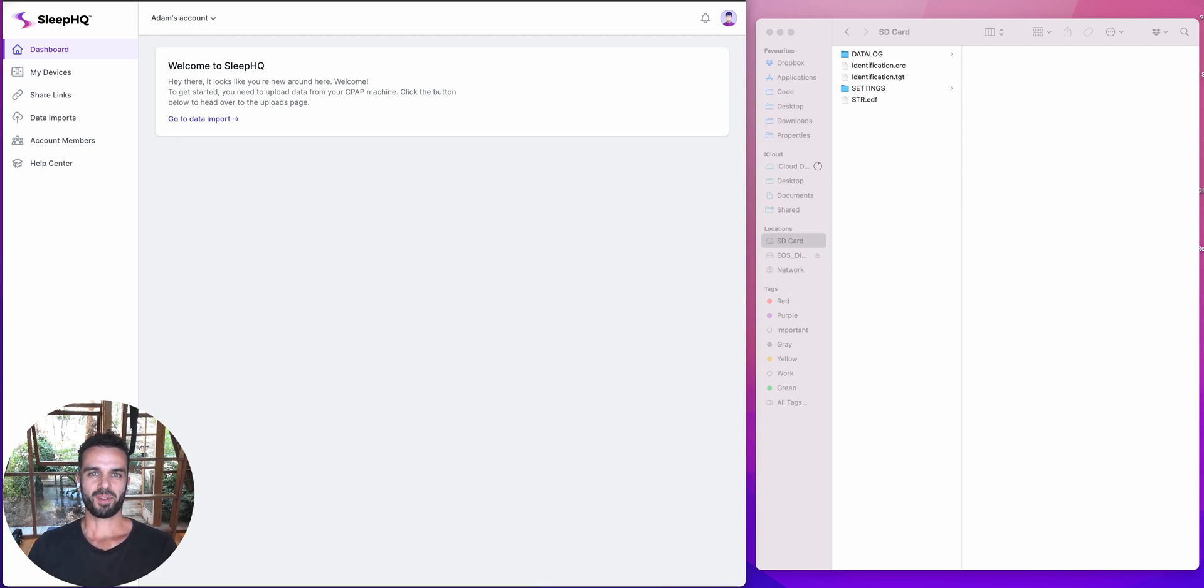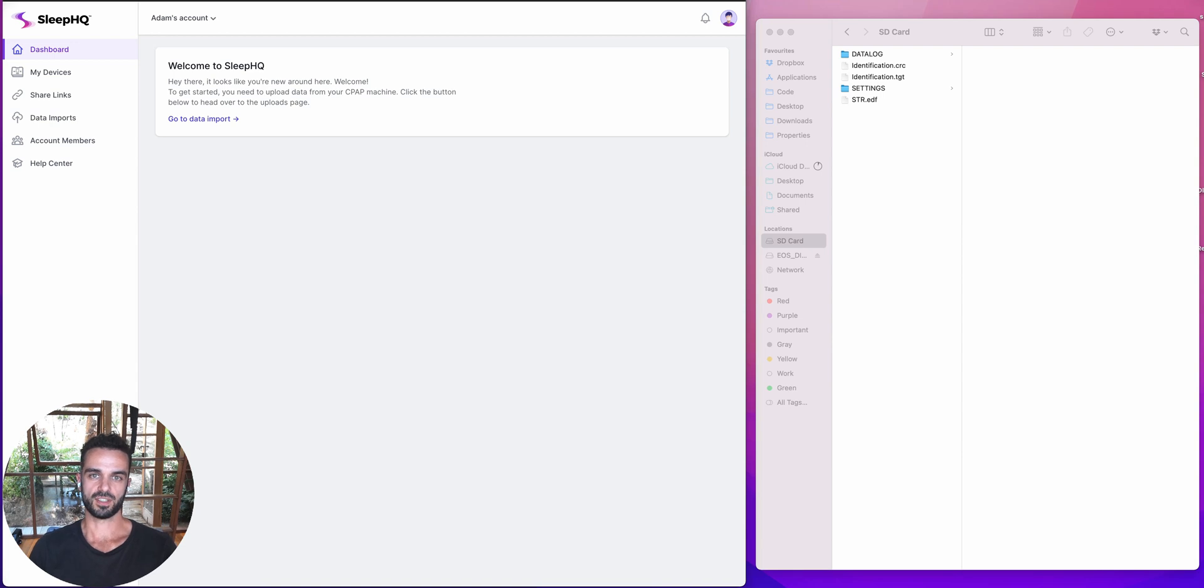Hey guys, Adam here from Sleep HQ. Today, I'm going to be showing you how to get your data from your CPAP machine into Sleep HQ.